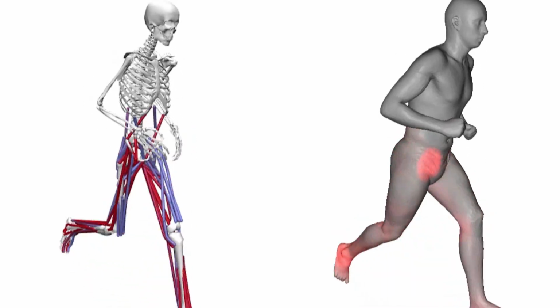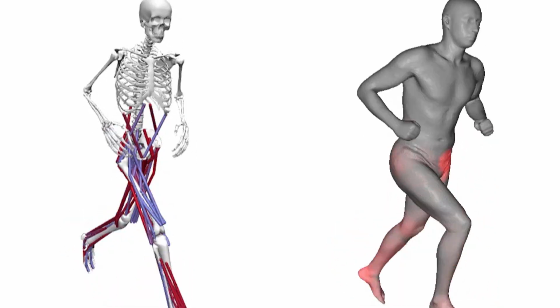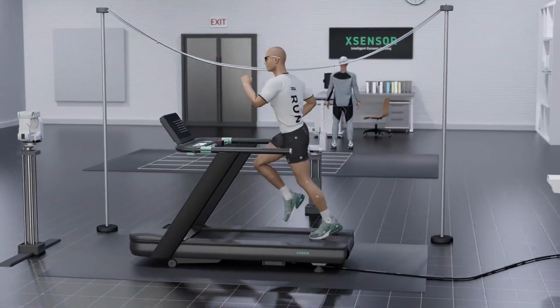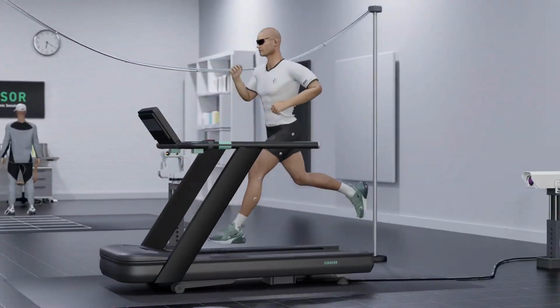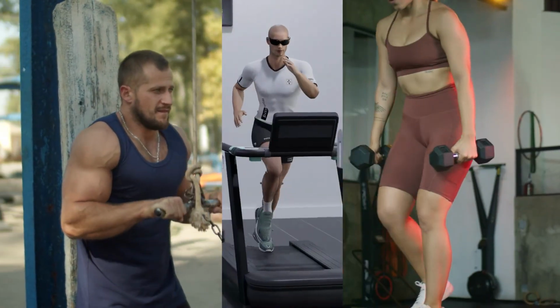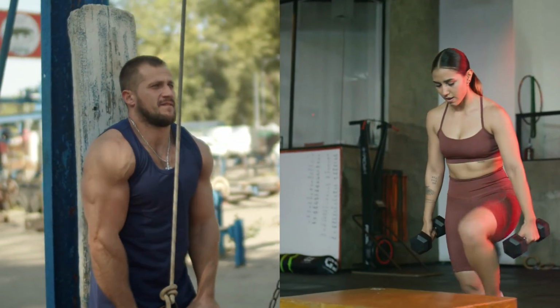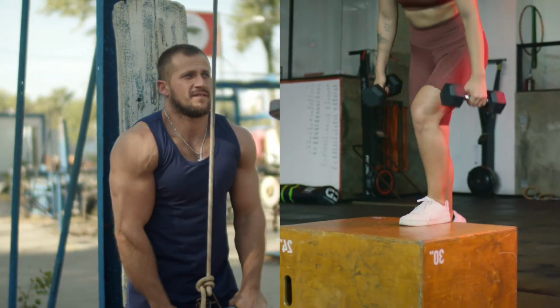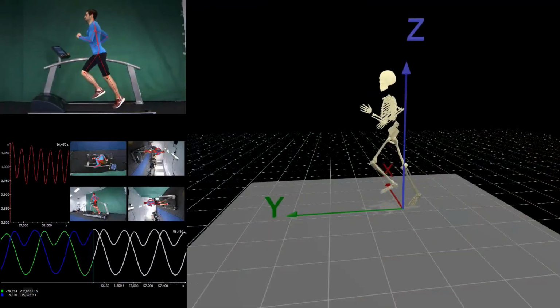5 minutes to understand the University of Twente's open source real-time CEINMS-RT computational model. Have you ever wondered, is there a way to see in real time how your muscles contract, how forces travel through your body, and how each joint bears its load as you take every step? In sports science, rehabilitation medicine, and exoskeleton engineering, this has long been a tremendous challenge.